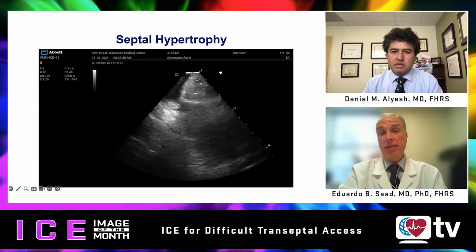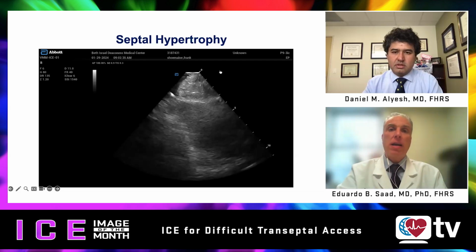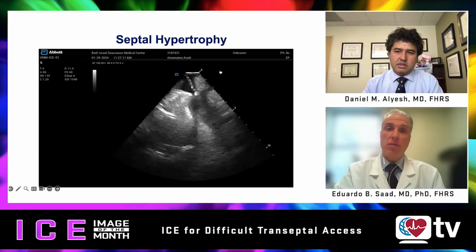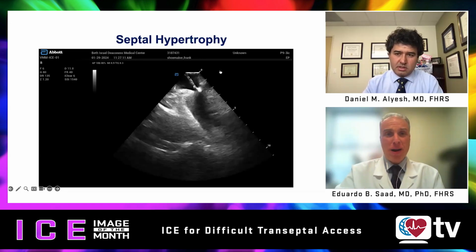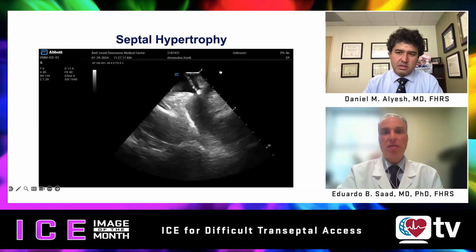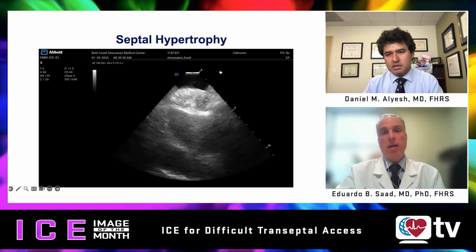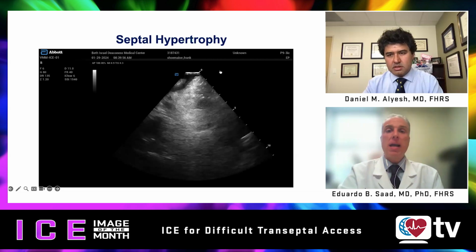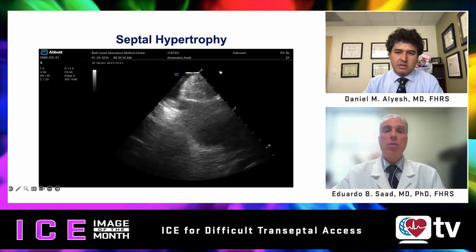So there were a lot of barriers because of cost issues and trouble with sterilization and re-sterilization of catheters. So I made a decision that I would not just allow that to prevent me from using it. I did everything I could in terms of showing not only insurance payers, but also hospitals and even patients the importance of doing whatever we need to do to have it available.